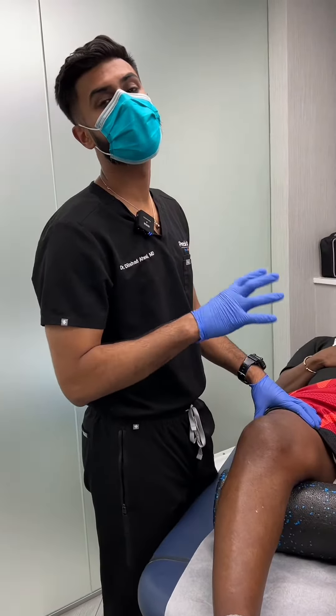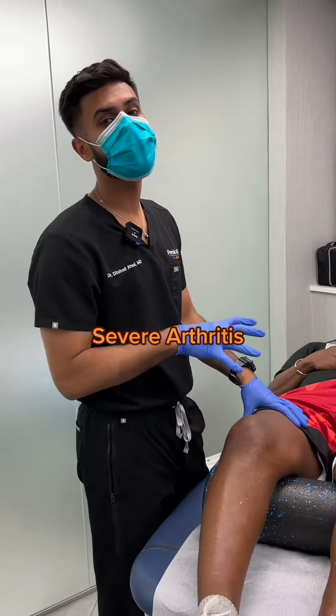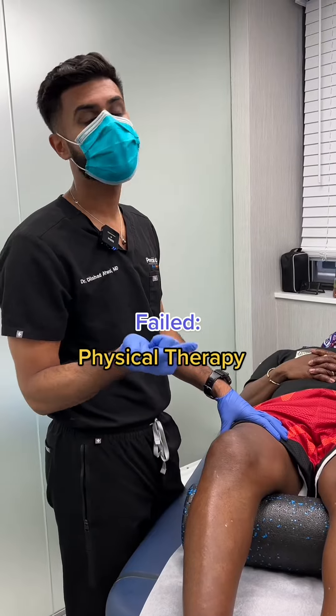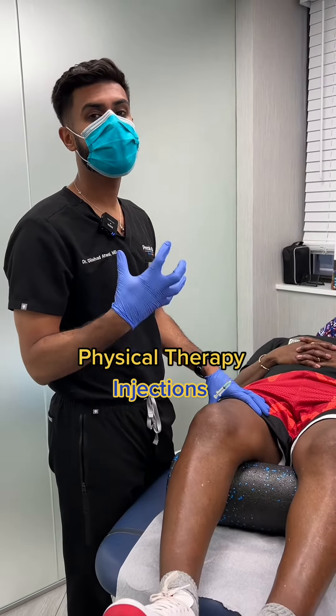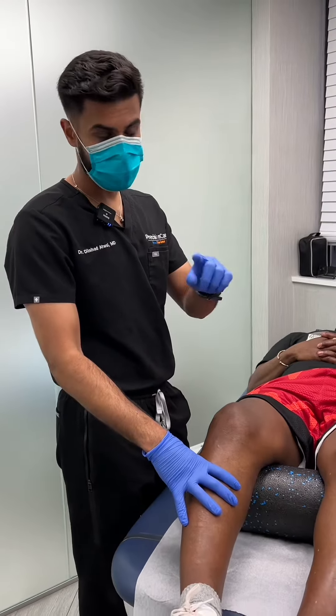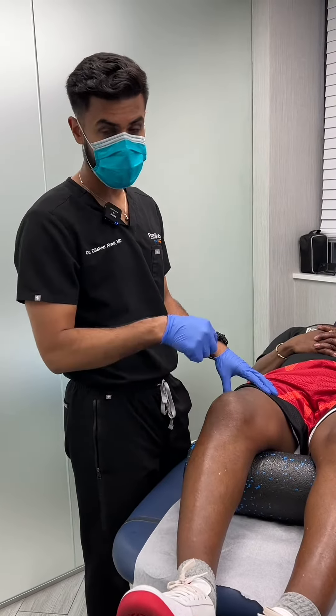So in this patient, this is actually a 56-year-old male. He has some pretty significant arthritis in his right knee. He's failed physical therapy. He's failed steroid injections. So now he's coming to me today to do a genicular nerve block. The purpose of this is I take numbing medicine and I put it in three different locations in his knee area.